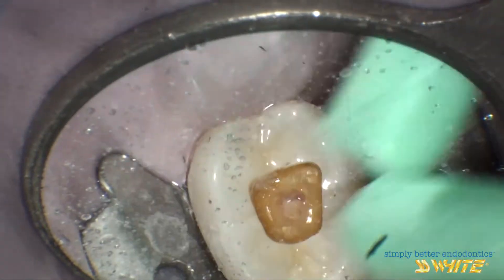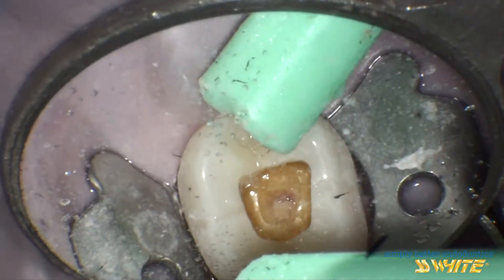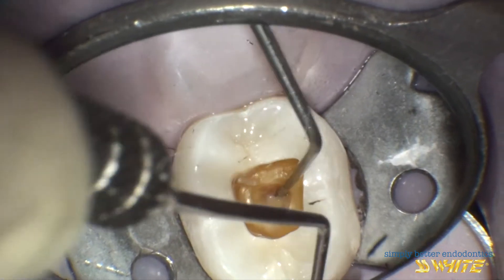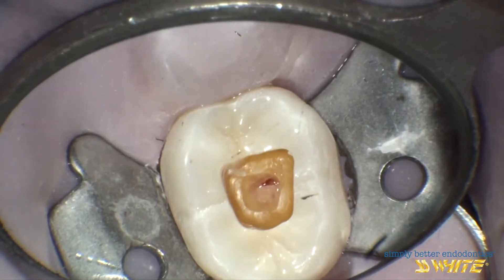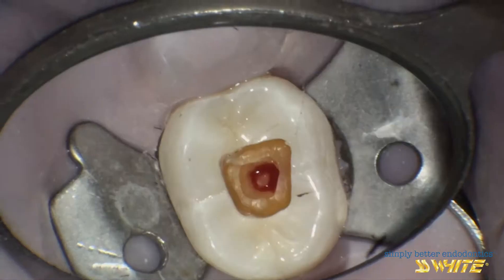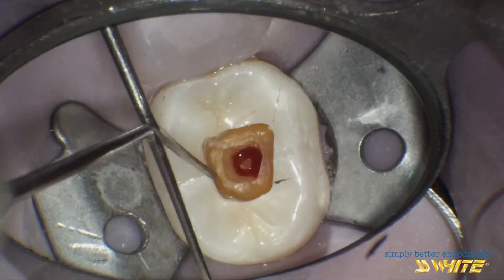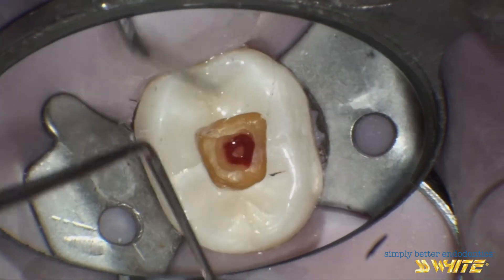This is the initial second step of the access prep and kicks off the top of the pulp chamber. You can see the pulp exposure on the MB corner of the prep. The explorer outlines the first step, which opened up the crown, and the second, more conservative step into the actual pulp chamber.